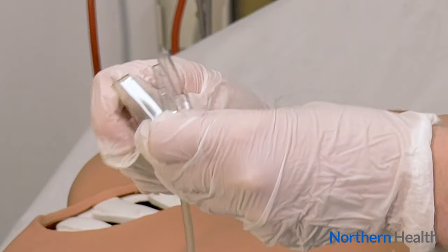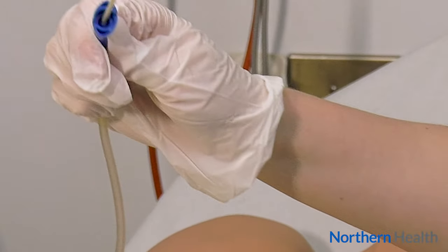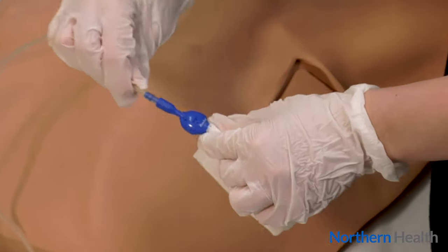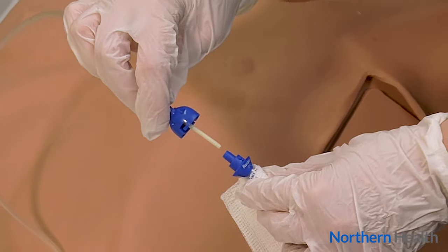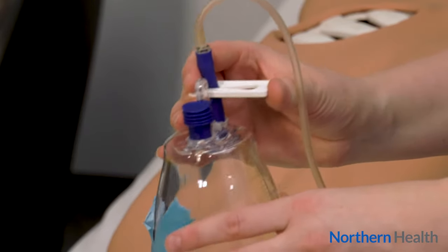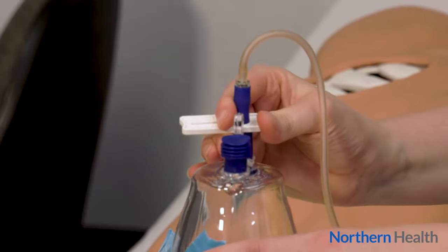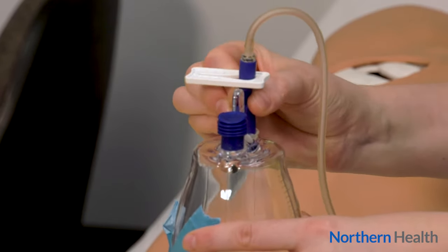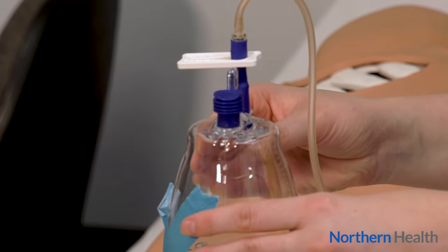Undo the plastic protector over the access device, making sure not to touch it. Pick up the end of the catheter and insert the access device and twist clockwise to click together to secure. Ask the individual to undo the white clamp and squeeze the blue tubing underneath to make sure it is open. If the patient is unable to do this, undo the white clamp before you hand the bottle to the patient.